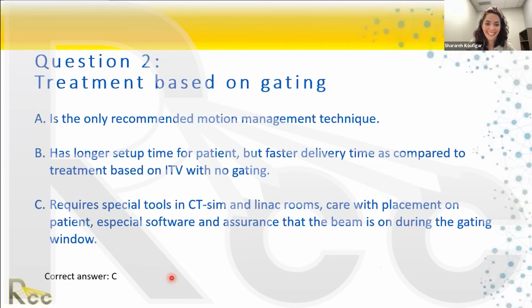Tomorrow we'll talk about the different patient immobilization, like the head and neck mask, the spine, if you're doing prostate, and so on. So tomorrow is more practical about immobilization.